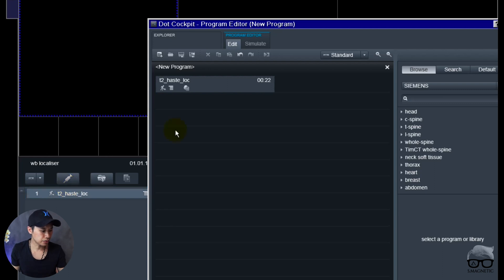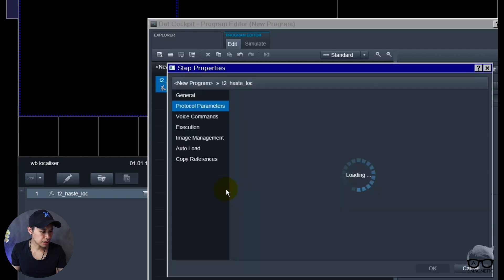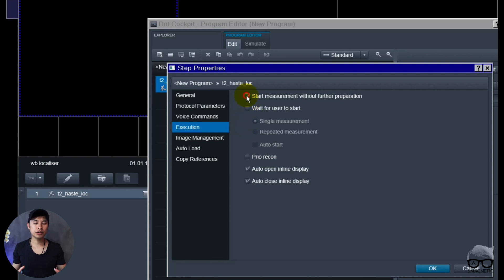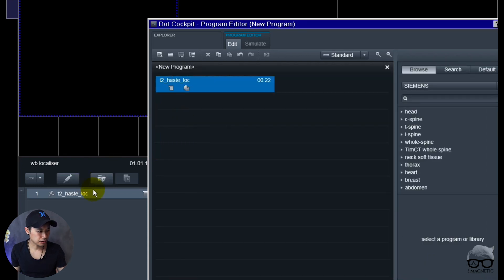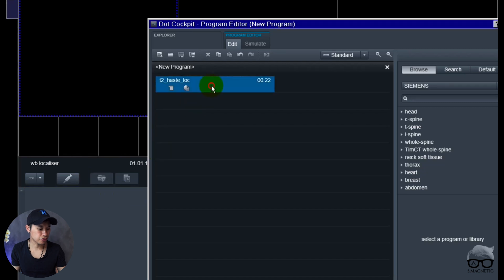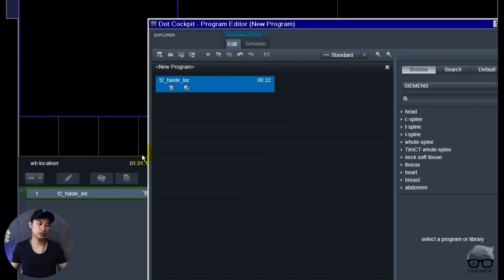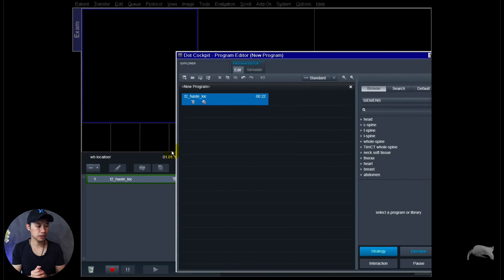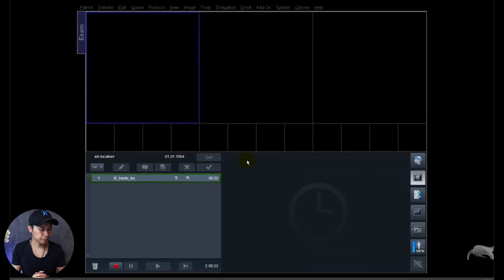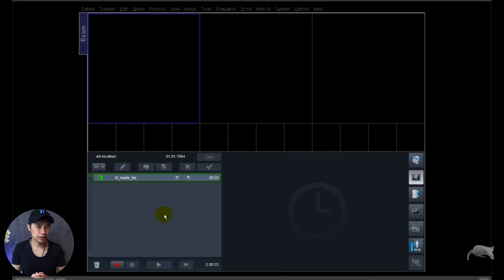And I also notice one thing, you can see the sequence demands you have to apply for the sequence but we don't want that. We want to drag over and it will start automatically. So to get rid of this we can right click, add the properties, execution, and then start measurements without further preparation. You don't need more preparation, you drag and drop, you want it to run and then okay.